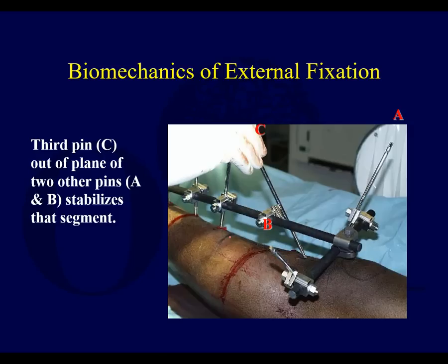If you had this situation and the frame had the opportunity to pull out in one direction, and this pin is oriented one way, and another pin is oriented another way — well, this pin is clearly now coming at a different angle, out of plane from the other two pins.